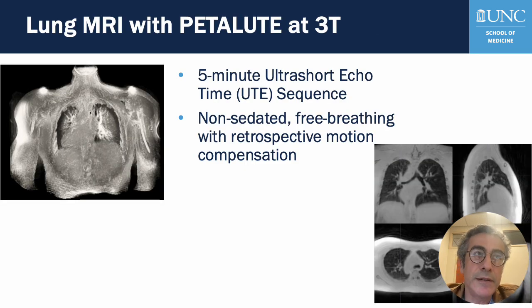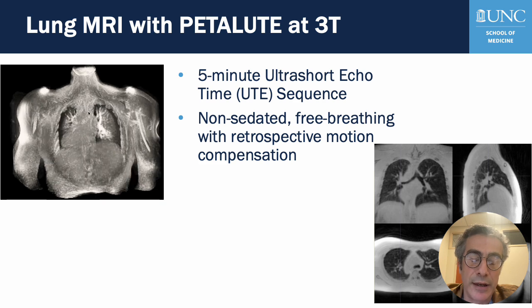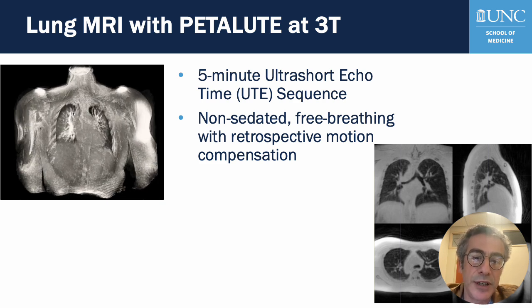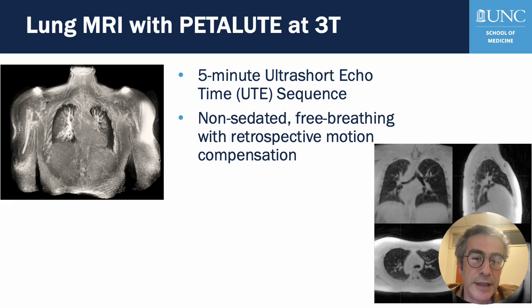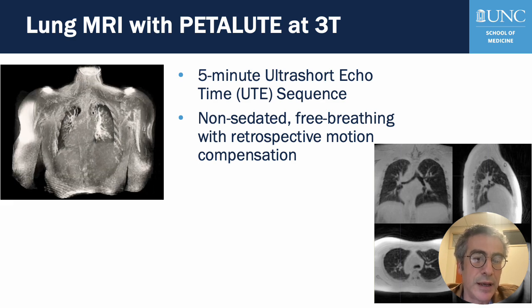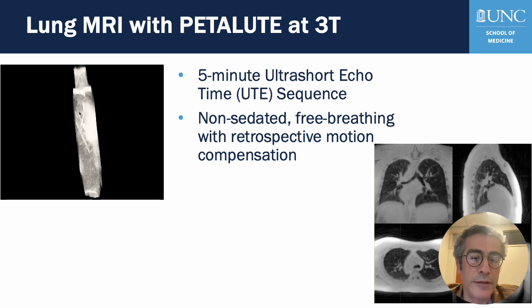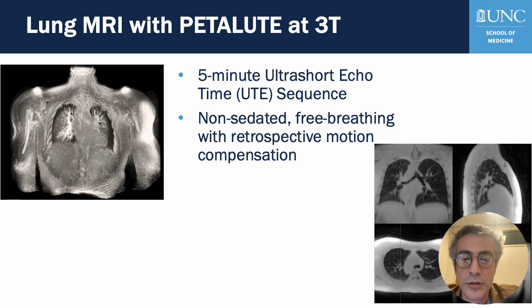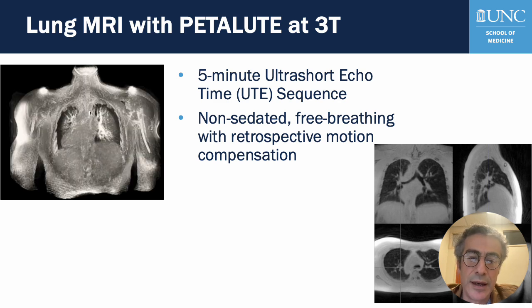Also, the success of PETALUTE pushed us to try more complicated organs like the lung. As illustrated, we acquired a 5 minute PETALUTE acquisition in free breathing with retrospective motion correction. Here we acquired very high resolution lung images, and this allows us to monitor the motion intervals easily using IMOCO reconstruction.